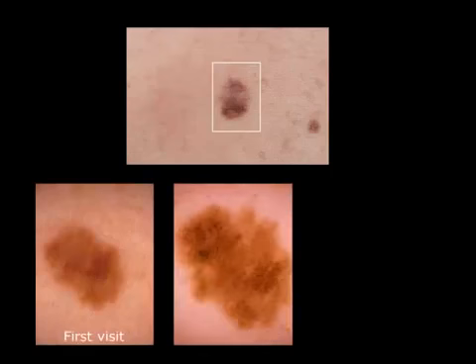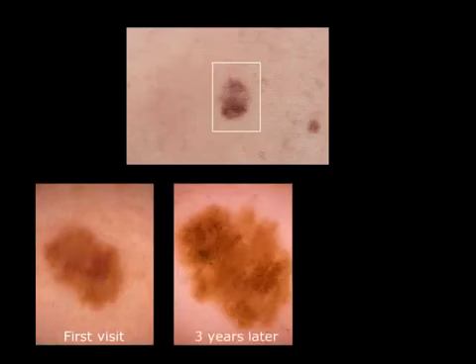This is an obvious melanoma clinically, but this melanoma has a history. Here we can see this melanoma when the patient came for the first visit, and dermatoscopically it didn't look like a melanoma — it looked like a nevus. The pattern is brown globules or clots and there is only one color, light brown. There are no clues for melanoma. But three years later the lesion changed dramatically.